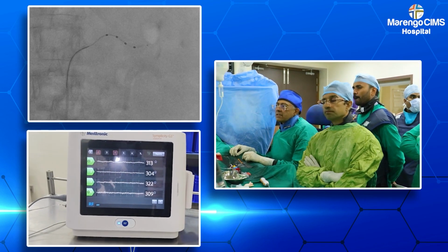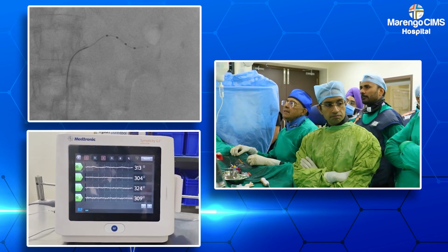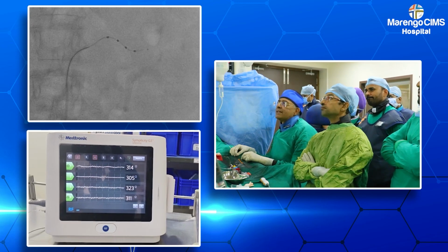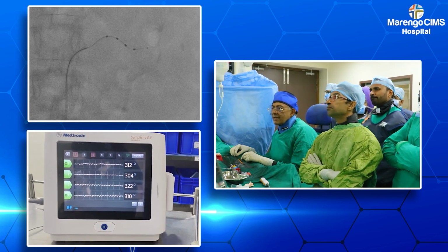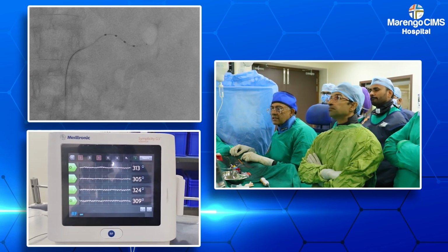Now we have replaced the catheter in such a way that to define the anatomy, there are 3 large inferior branches and 1 large superior branch. We have decided that in the 3 inferior branches, the distal one branch we would not ablate because it enters the cortex.